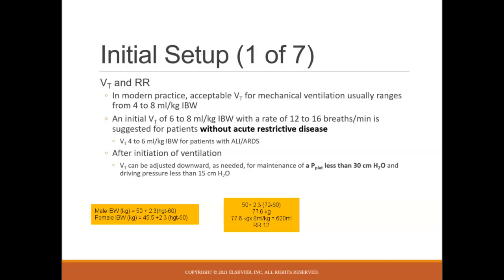Just like this scenario, I decided on these settings, I need to then put the patient on them and see if there's any negative impacts. So what negative impacts am I looking for? I'm looking to make sure that my plateau pressures are less than 30. So if I come over to my patient and I'm doing my assessment and my plateau pressure on these settings ended up being 35 for whatever reason, I could go, whoa, 35, that's not good. So what do I need to do? I know I need to decrease my tidal volume to get this plateau pressure within a reasonable limit.